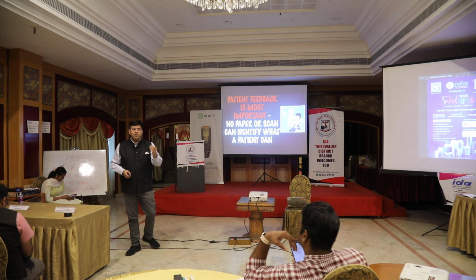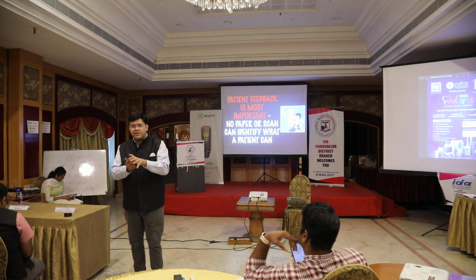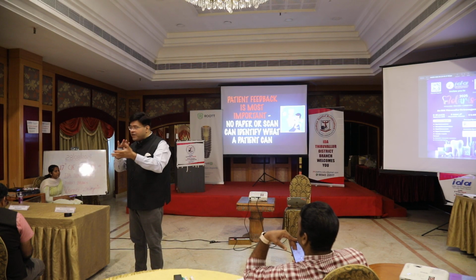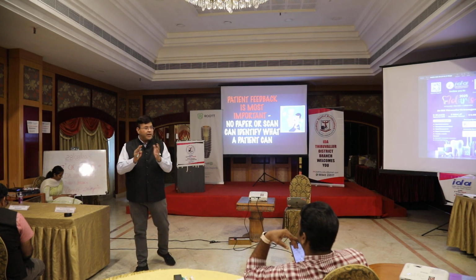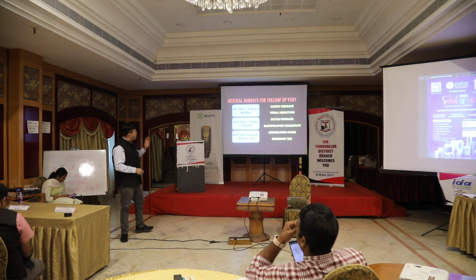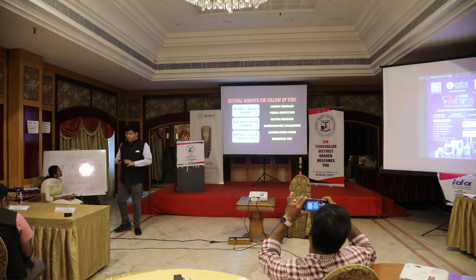And also let me tell you that these patients, when you keep doing these repeated movements, are they going to give the same intensity of movement every time? Even we do not bite with the same intensity, right? So it is a very qualitative process. Every time it keeps on changing. That is why you need to keep following it up as well. This is how we do the follow-ups for all our implant cases.